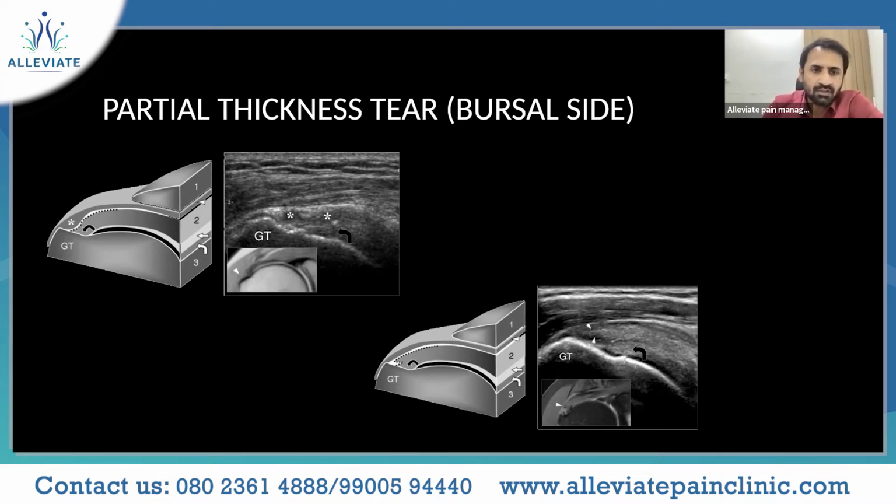Two is your supraspinatus tendon. Then comes your articular cartilage and your glenohumeral joint. In this, you can see that there is a bursal side tear of the superior fibers, and you can see the asterisks where the hypoechoic fluid has collected.